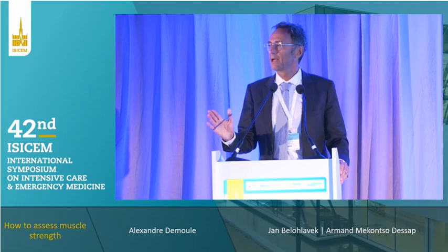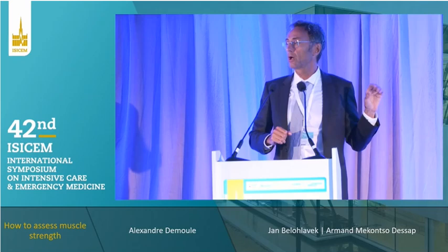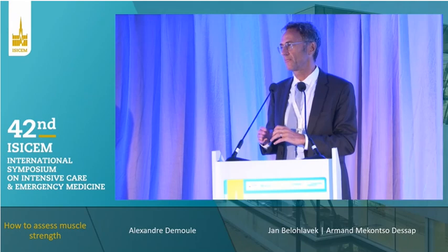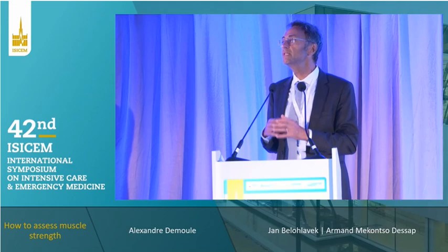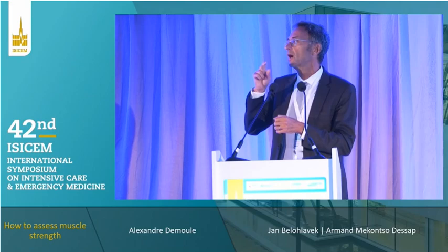It's a great question. We need more standardization. The problem is the cutoff values I gave you are from studies in which patients were at a pressure support level of 10 plus or minus 2. Personally, what I suggest today is to measure under zero pressure support and zero PEEP. We need to standardize this value with 0, 0, and now we do it with 0, 0. In some units, they just disconnect the patient from the ventilator the time they do this. But it's okay. So we do 0, 0.